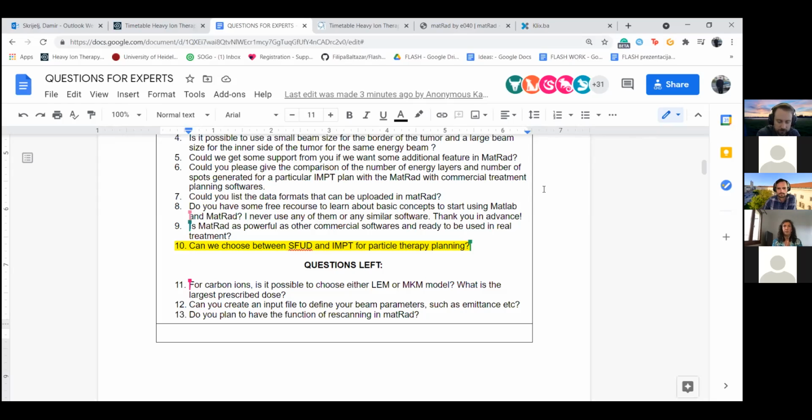Going to more complex beam shapes, where you basically need a bi-Gaussian emittance parameterization or something like this, there's also a research branch where we do this, especially on the Monte Carlo development side. So you see, all of this is kind of ongoing work. And if you have such questions, always the best thing is to go on GitHub and ask. I think there are 1 or 2 open issues at the moment on GitHub that deal with this, where then I or someone else answers to tell you, oh, look at this development branch of matRad here. Here you can do it and you can change your beam parameters and so on.